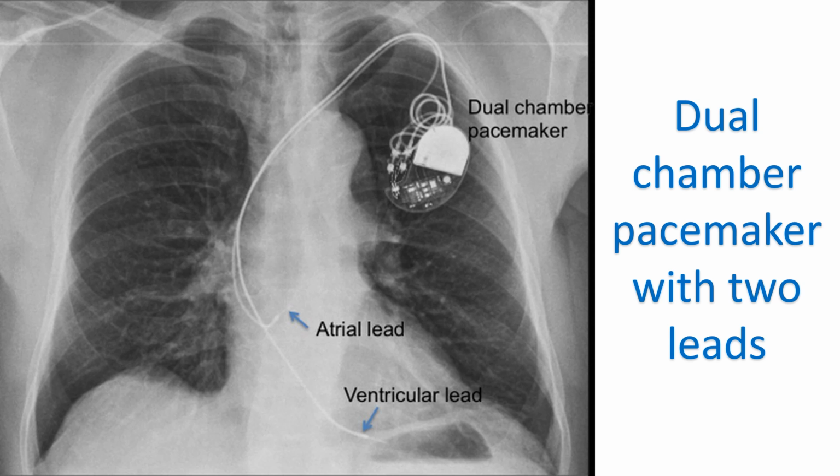Pacemaker syndrome can be treated by upgrading to a dual chamber pacemaker. In dual chamber pacing, two electrode wires are used, one in the right upper chamber and one in the right lower chamber. The signal to the upper chamber is given first, followed by the signal to the lower chamber after a short delay. This is known as AV sequential pacing.